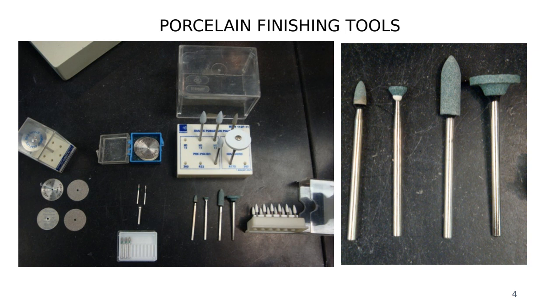What does coarse, fine, and the texture have to do with it? Coarse and fine, because you start with the coarse, right? So when you redefine your anatomy, let's take the example: you cut the sprue. How do you cut the sprue? You use a diamond burr, right? You use a diamond burr, you cut the sprue.